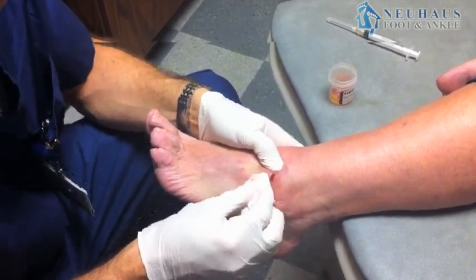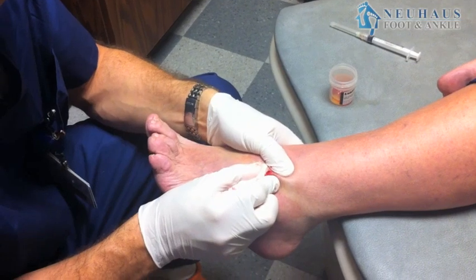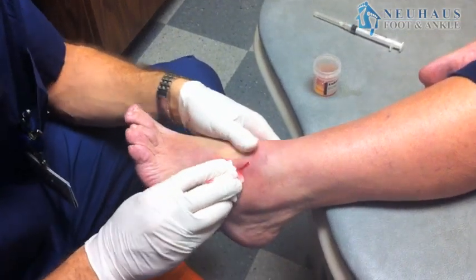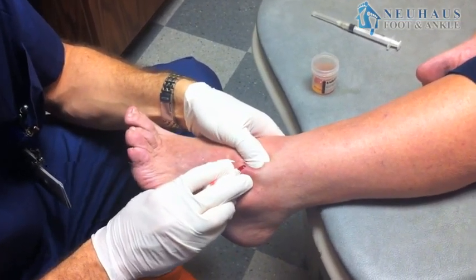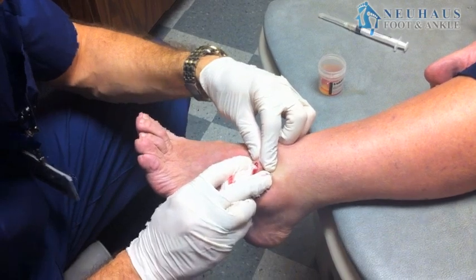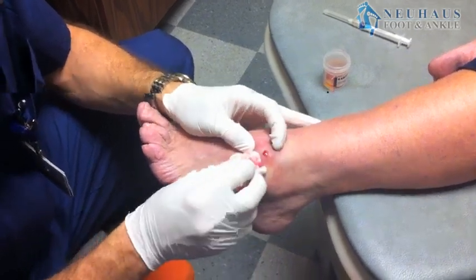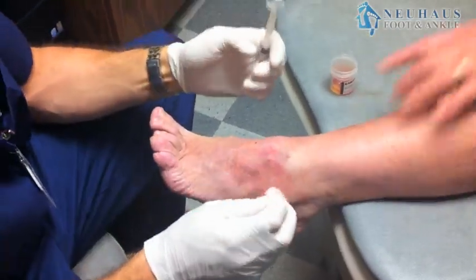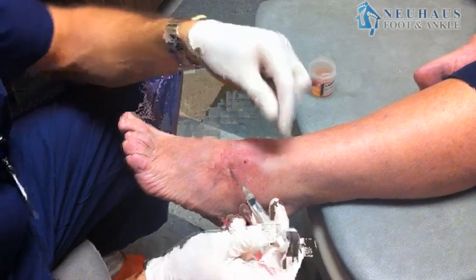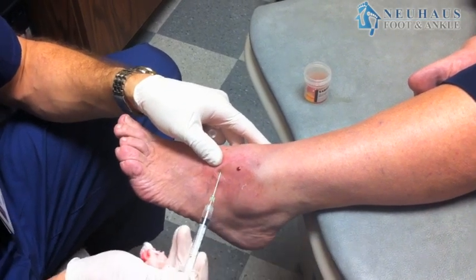Then you try to milk it — really squeeze it out. Afterwards, typically we'll go ahead and put cortisone in. A steroid injection after you've drained as much fluid as possible will try to shrink up the cyst itself. I like to describe it to patients as making the sides kind of sticky so they stick together. That's probably the best explanation of how the steroid works — it dissolves the inflammation so the sides of the cyst almost seal themselves off.